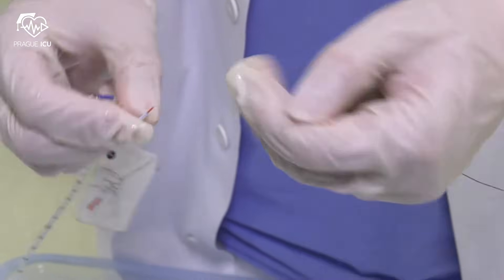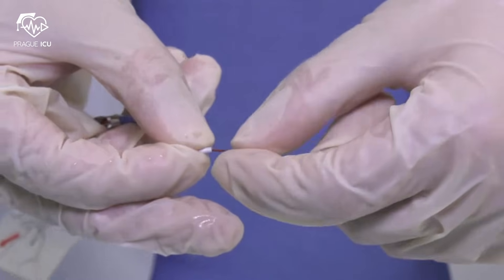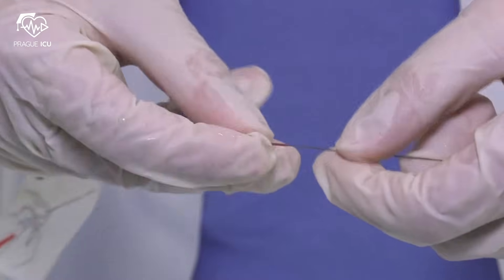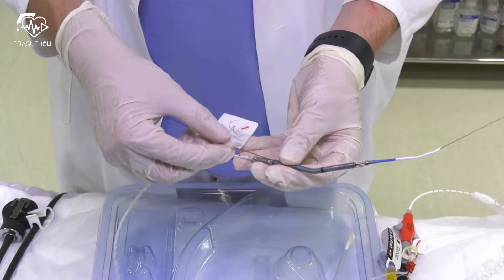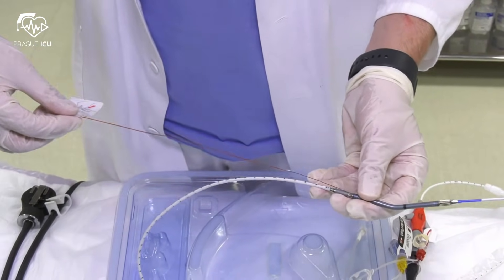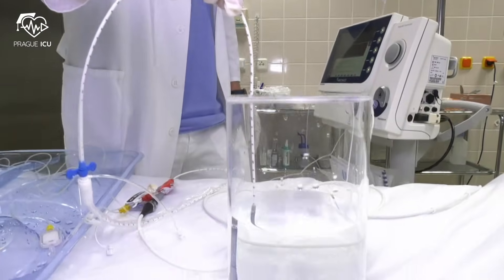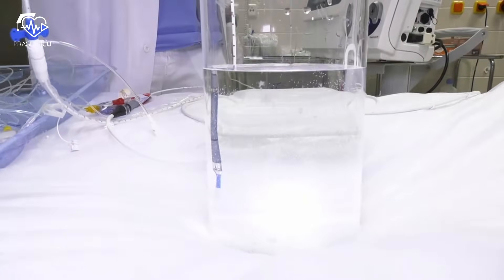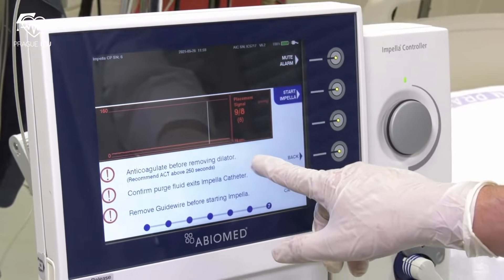The Impella catheter is now ready for insertion to the patient. Insert the proximal end of the guide wire into the orange easy guide lumen through the pigtail, which should be straightened. Advance the guide wire until it exits the red lumen near the label. Remove the easy guide lumen by gently pulling the label in line with the catheter shaft while holding the Impella catheter.